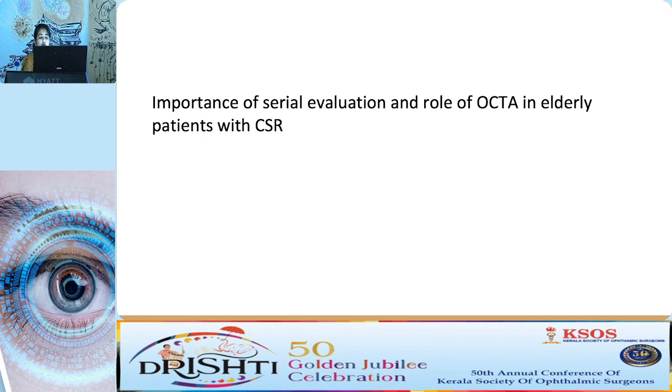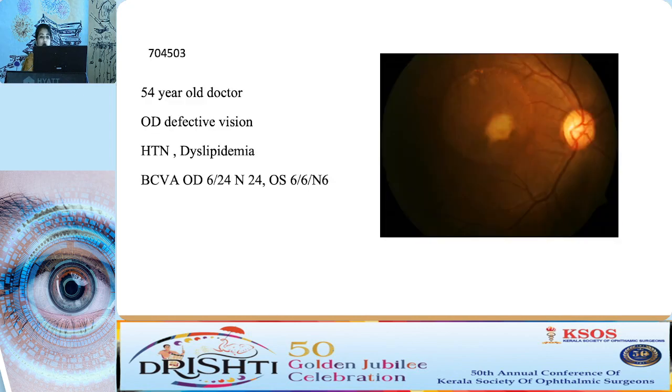So what is the importance of this particular case? It emphasized the need for serial evaluation and the role of OCTA in elderly patients with CSCR. This patient might have converted from an acute CSR over the years to a PCV. So if it was not followed up, then we would have missed it, and the role of OCTA as a follow-up tool.